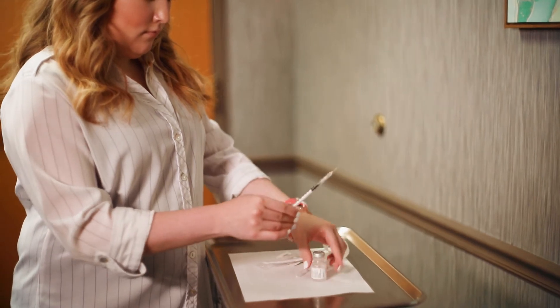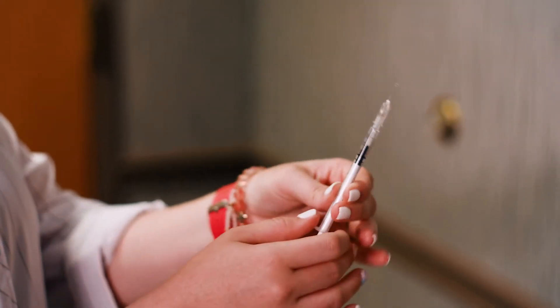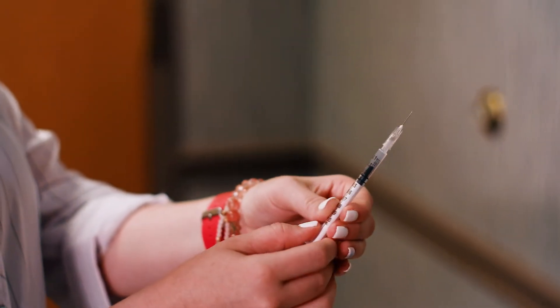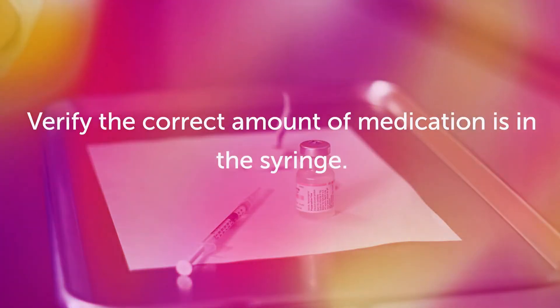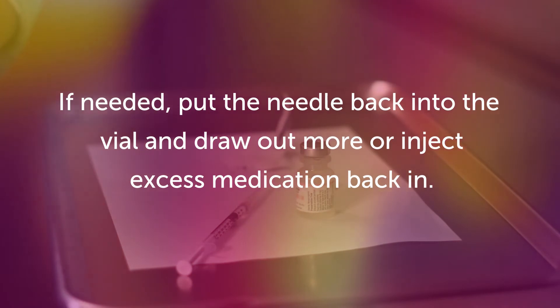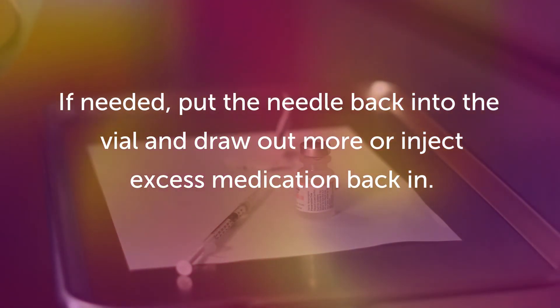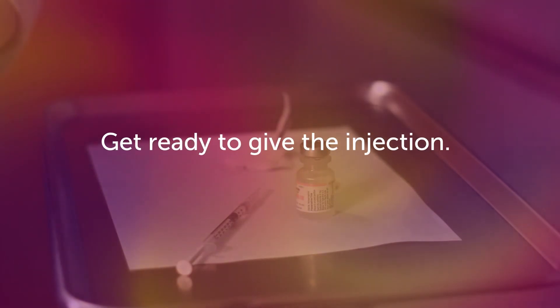If any air bubbles accumulate in the syringe, tap the syringe until you see the air bubbles rising to the top of the syringe. Gradually push the air out of the syringe. You may see a drop of liquid at the end of the needle — this is normal. Verify the correct amount of medication is in the syringe. If needed, put the needle back into the vial and draw out more or inject excess medication back in. Get ready to give the injection.